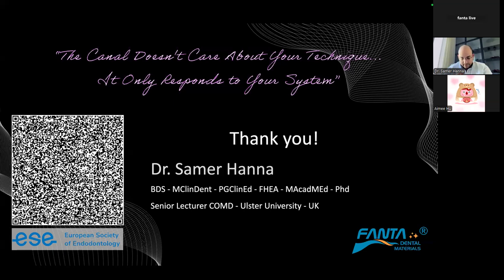Yes, thank you, Dr. Samer. There is one question in the comment section, asking about using EDTA solution or gel in blocked canals. Okay, that's a very good question, and we didn't talk about it today, but EDTA is a very essential tool, especially in blocked canals. So I always say we use the EDTA gel, which is the cream form, in negotiating the canals. At the very start, if I cannot reach my glide path in a correct way, I introduce the EDTA gel. It helps me with the dentine debris. It helps me with the lubrication, and it will make my file reach the apical part.